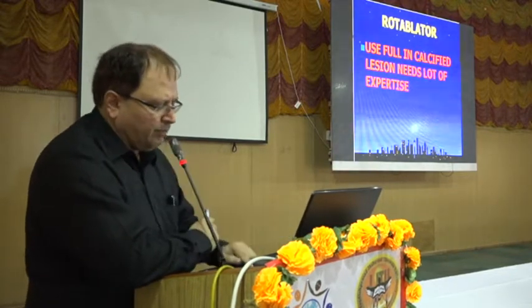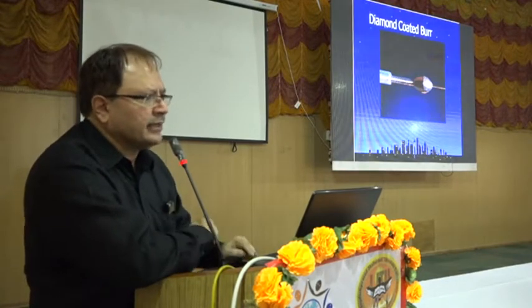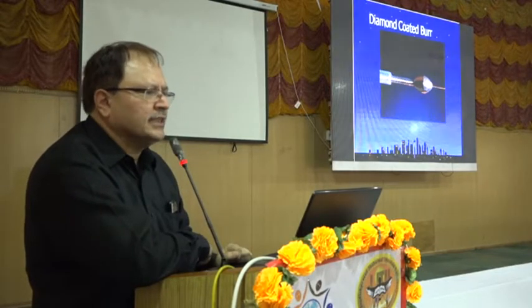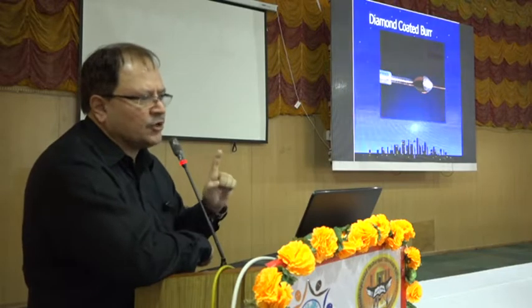In this, we put a rotabur. Basically, the rotabur is a diamond piece. So this will rotate at the speed of 160,000 rotations per minute.